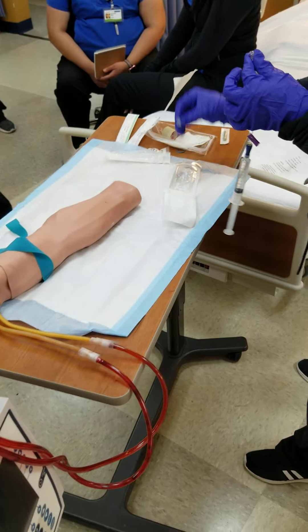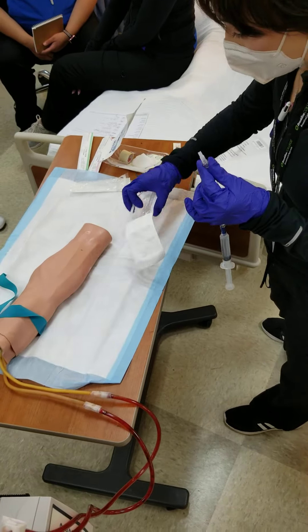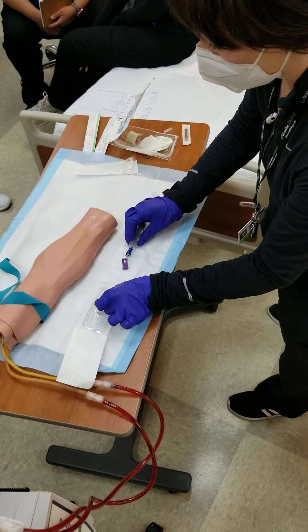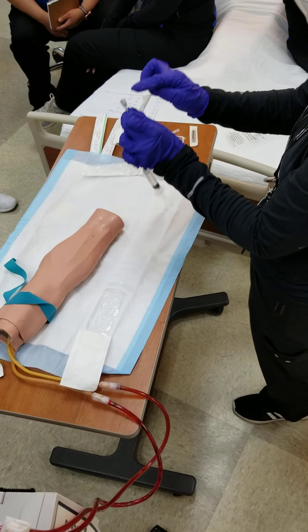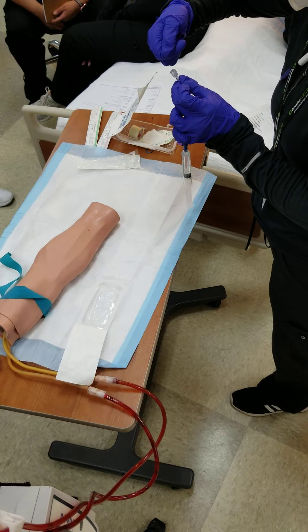Now you can put this little cap back on — make sure it's loose — or you can leave it up and let this hang out in here. Either way, this part needs to remain sterile because it's going to get hooked up directly to the catheter.